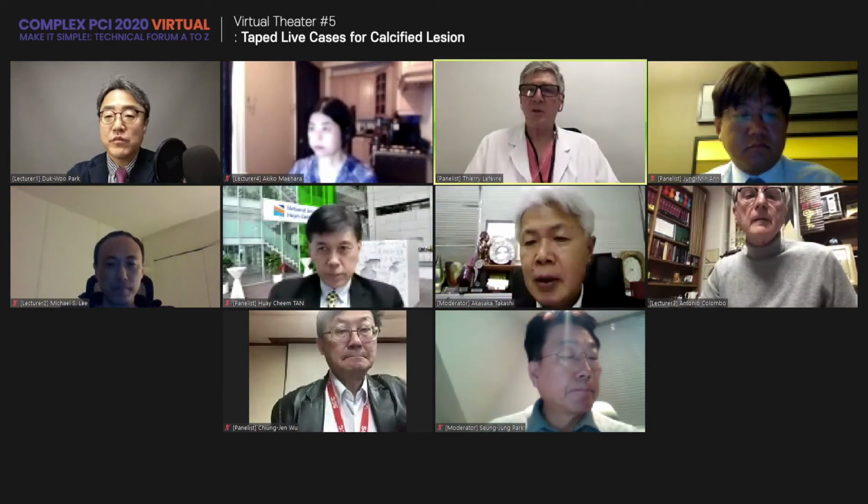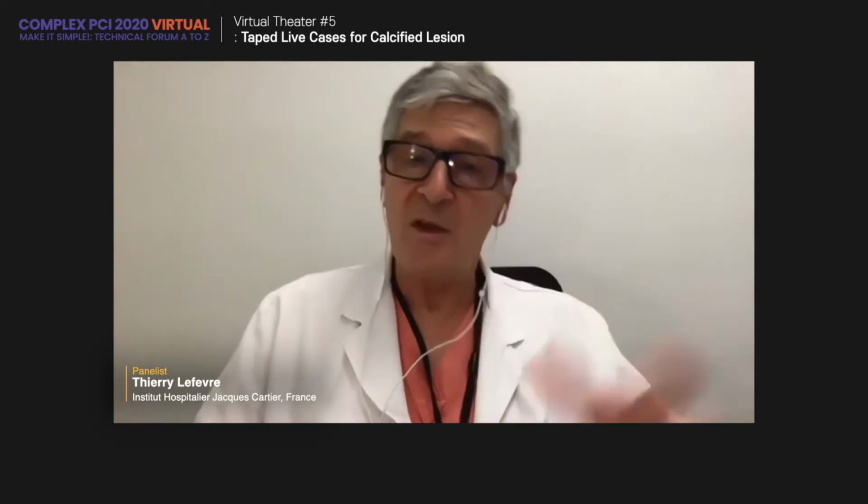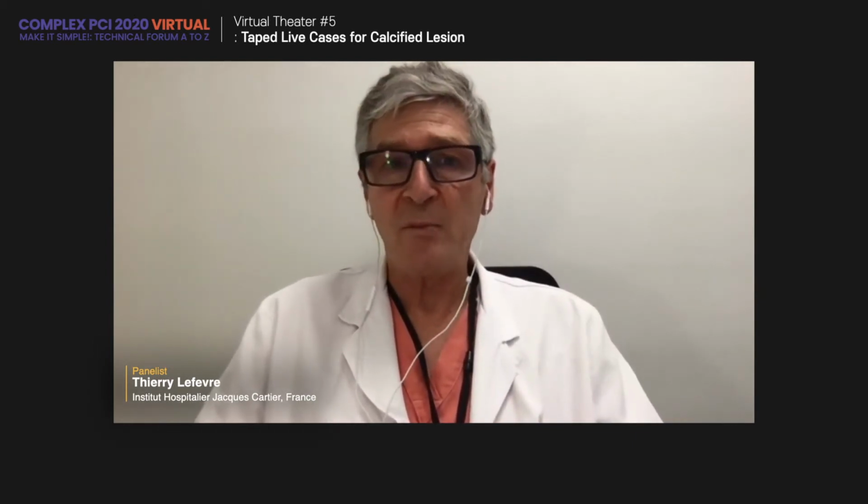I like very much the presentation of Antonio. I think it's based on the experience, and I think it's very important to underline the fact that OPN NC balloons are very useful. I think it's still underused in the world, and it's very important to know that sometimes you break the lesion after using other devices before, up to 40, 45 atmosphere.